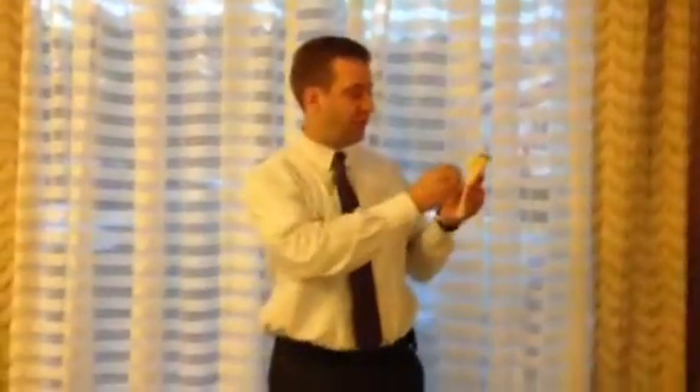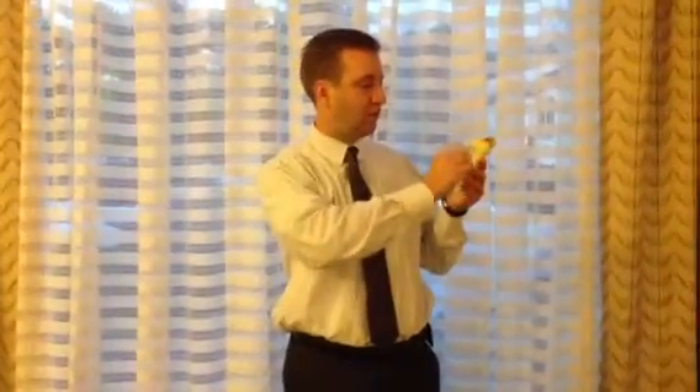Quick surgical pearls. Arthroscopically, it's always good to probably have an 8.5 by 55 cannula with you. The biggest issue with this device you're going to get is screw and tendon twisting. One way to prevent that is to use that 8.5 cannula when you're going to insert your screw arthroscopically — collapse it on top of the tunnel. That will help prevent tendon spin. The 8.5 by 55 is good; it's short. You can take your tendon out if you need to.